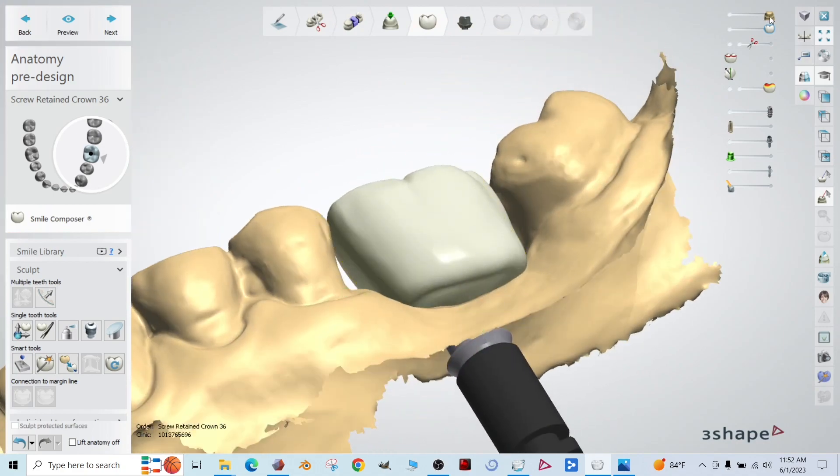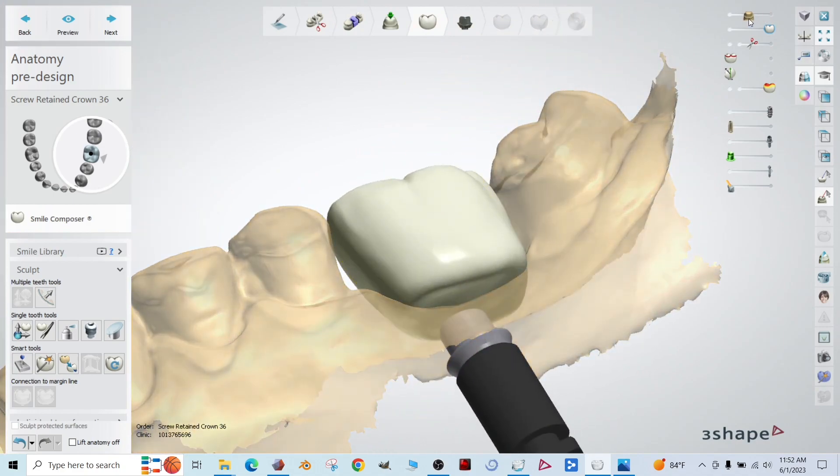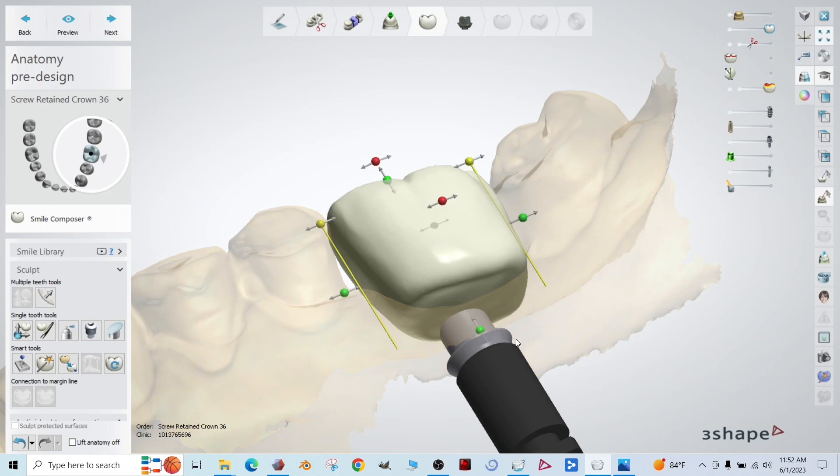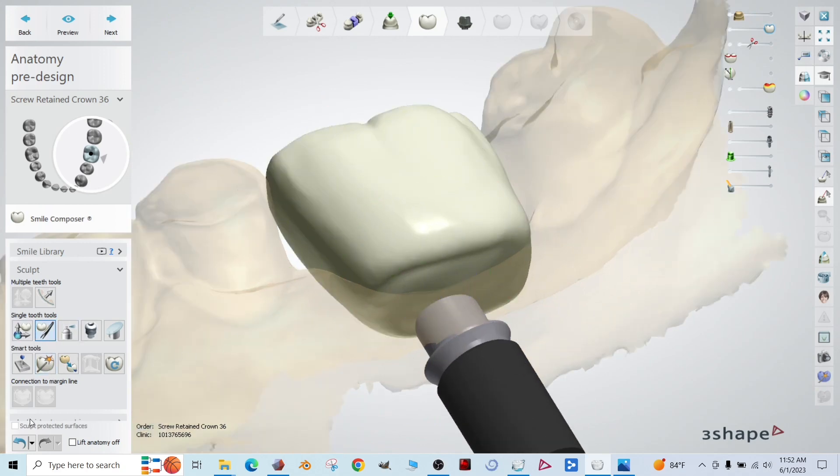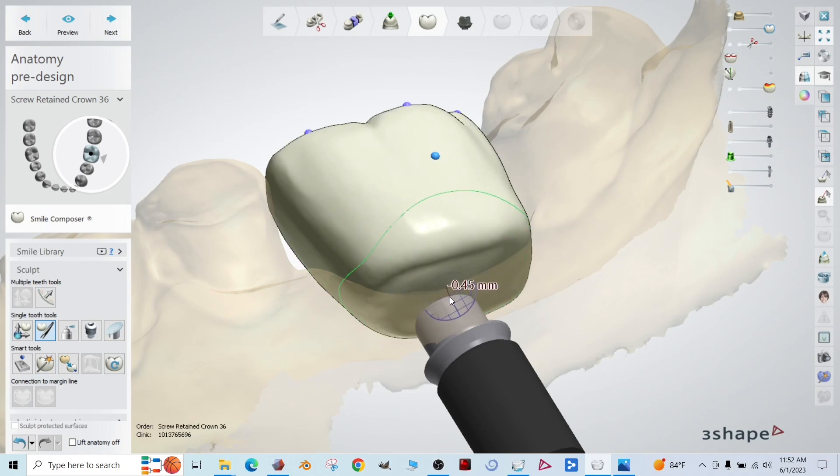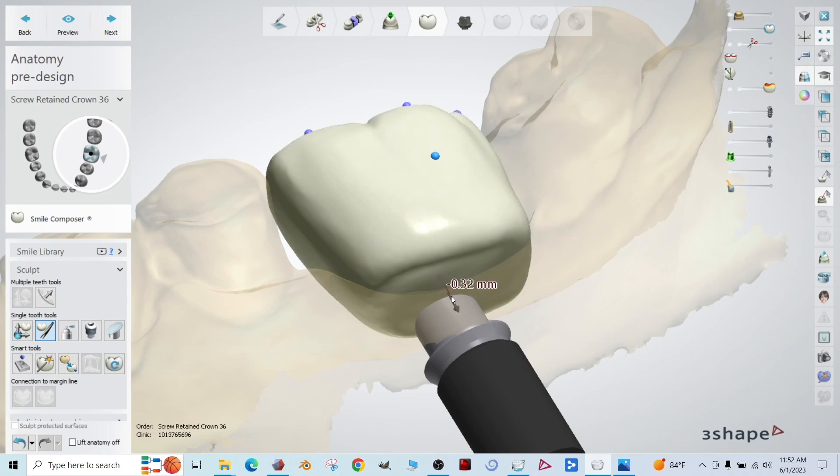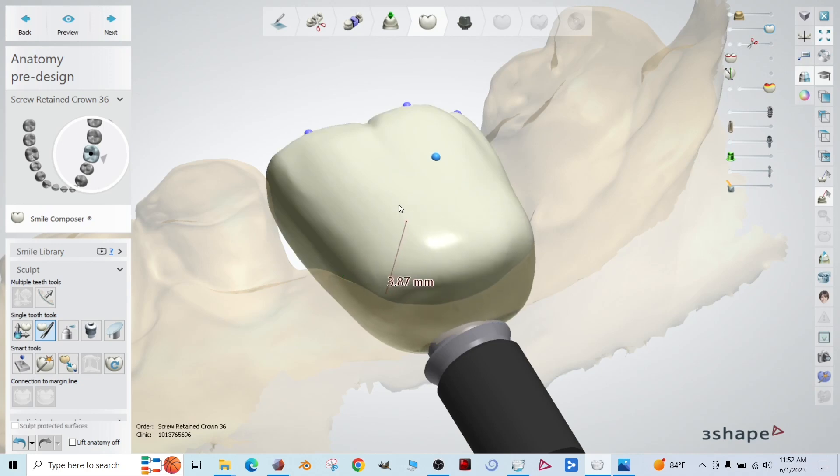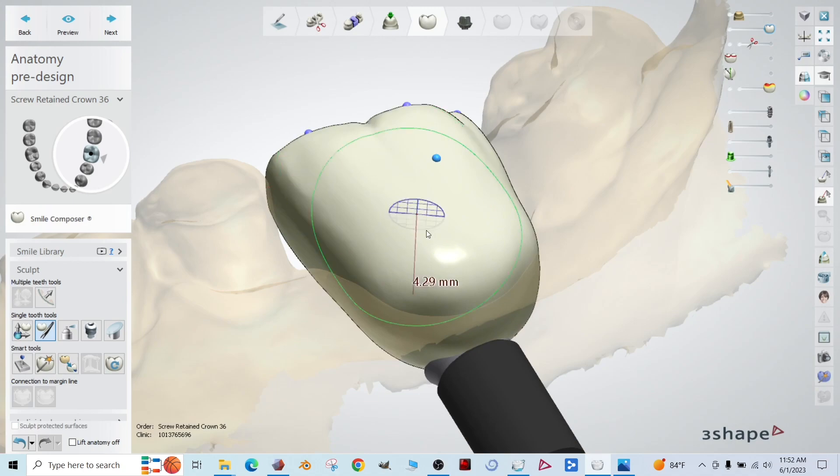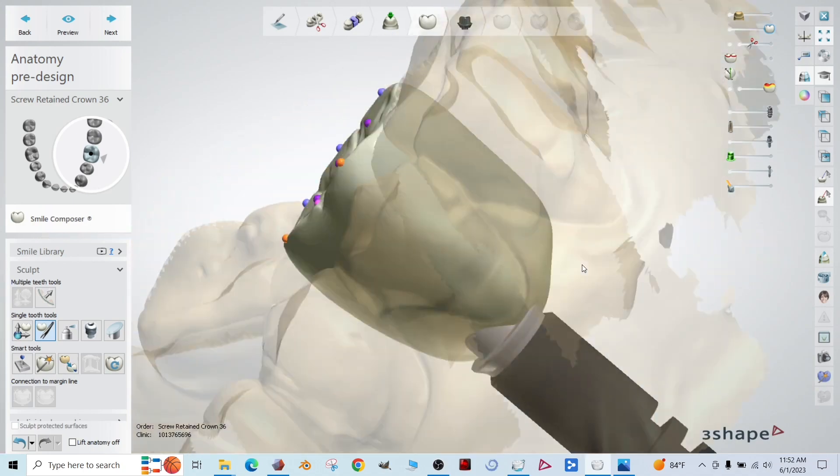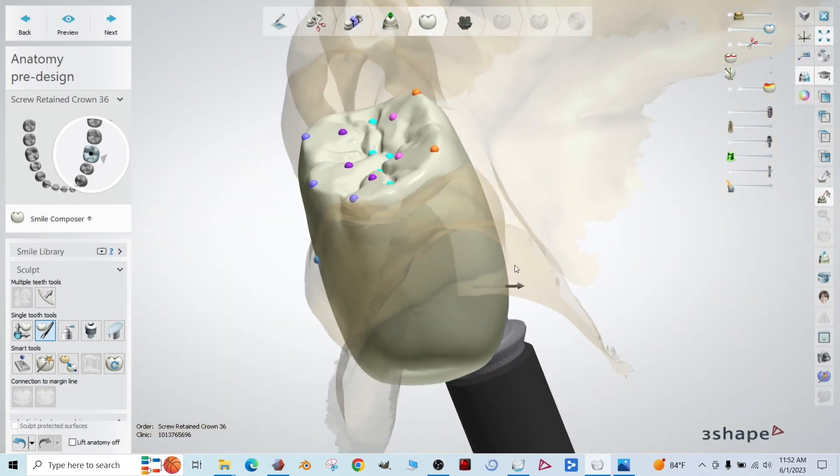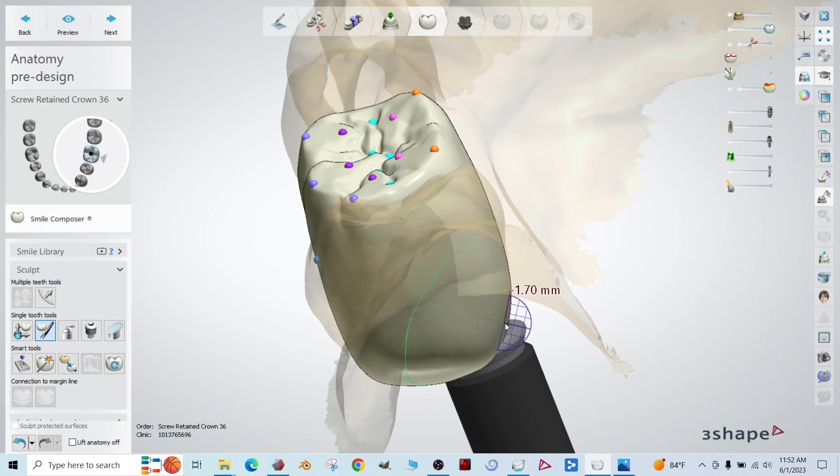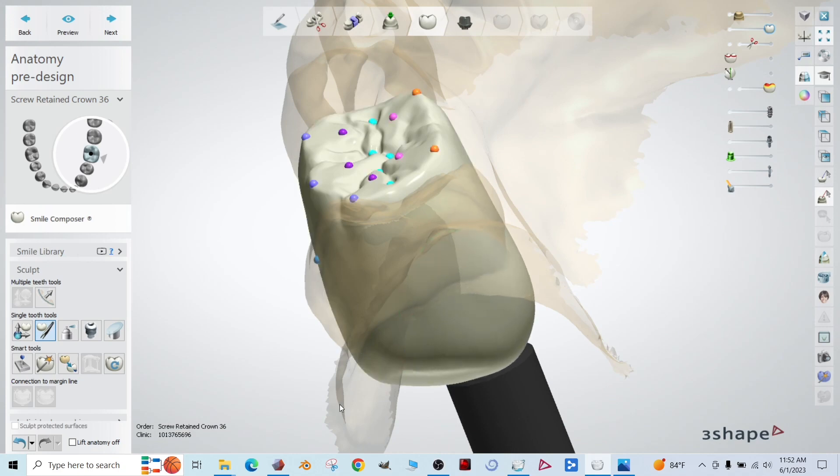Now we're going to do our best to position this crown to where we want the final restoration. The most critical part though is going to be where it emerges from the tissue. And let's pull that all the way down. One thing with this 3Shape crown is it's kind of flat on the bottom. So we're going to use our morph tool.